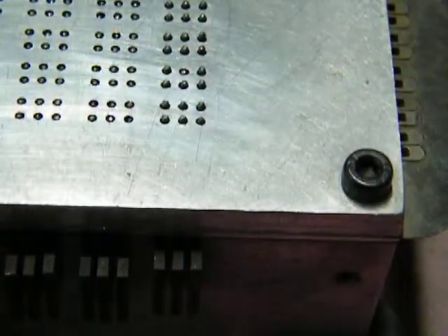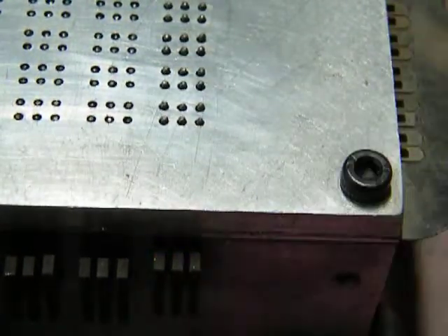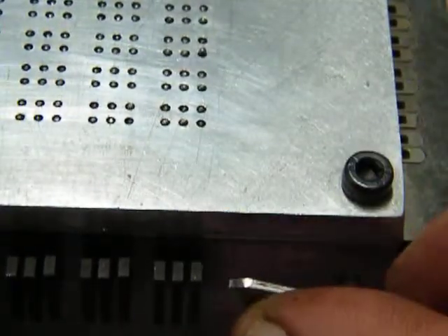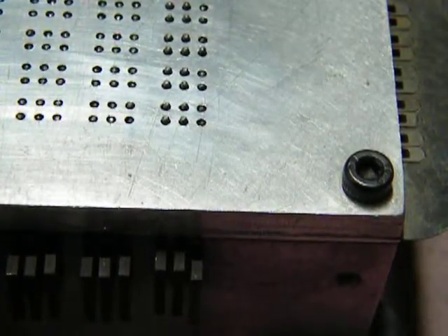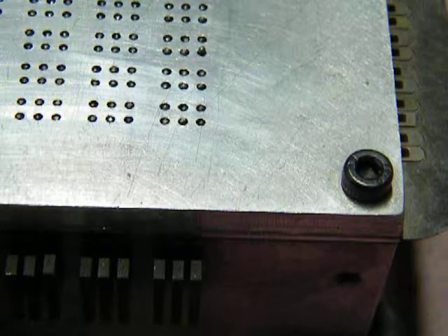I can drop them all by just, these are the row actuators. Row 1, 2, 3, drop. Cell, drop. Okay, I'll do it one at a time now. 1, 2, 3, drop 1, drop 2, drop 2 and 3 drop together, sorry. So that's the way they do.